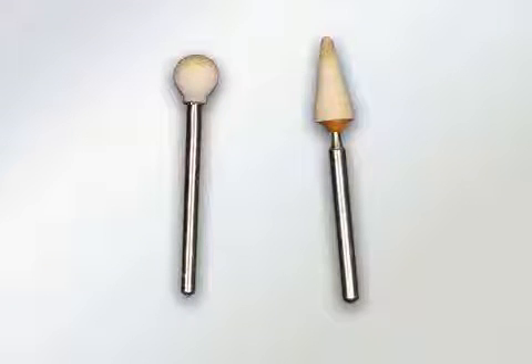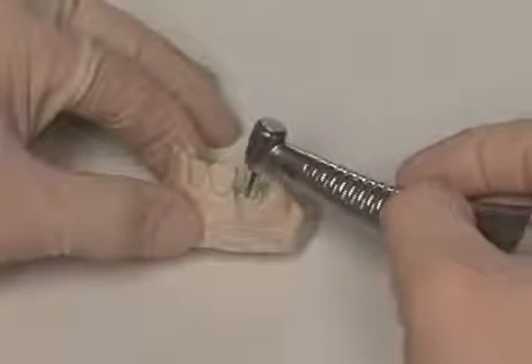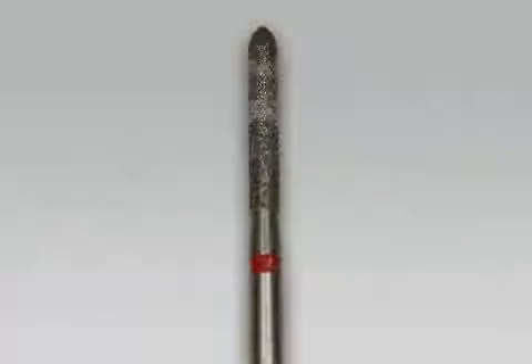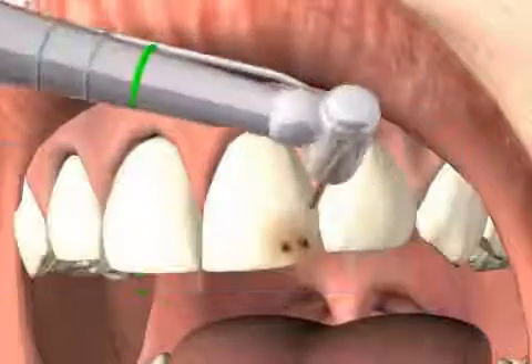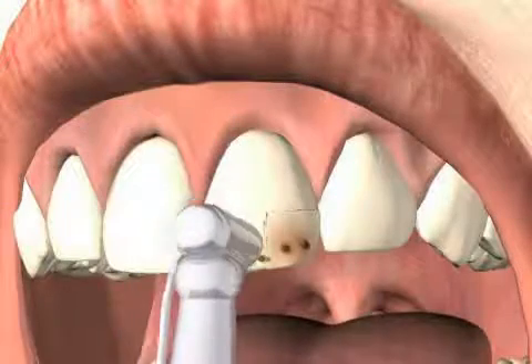In dentistry, Arkansas stones are most commonly used to smooth fillings. When the dentist grinds a tooth, this is usually done with a diamond grinder. As you can see in this picture, the rough surface of the diamond ensures minimal warming of the tooth during the grinding process. At the same time, hard tooth substance is efficiently removed.